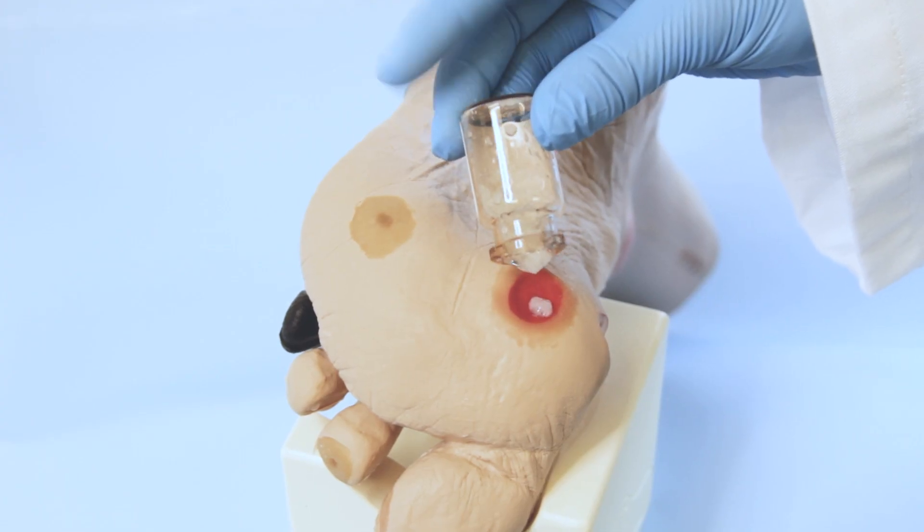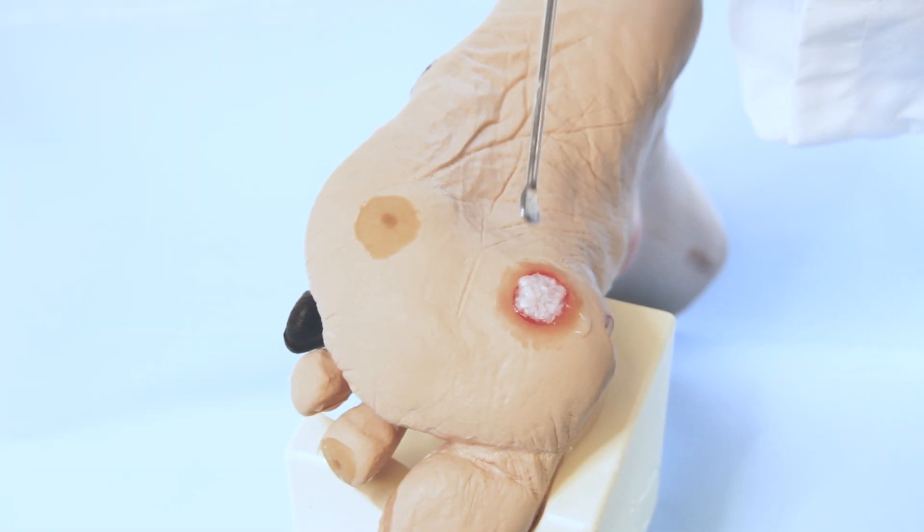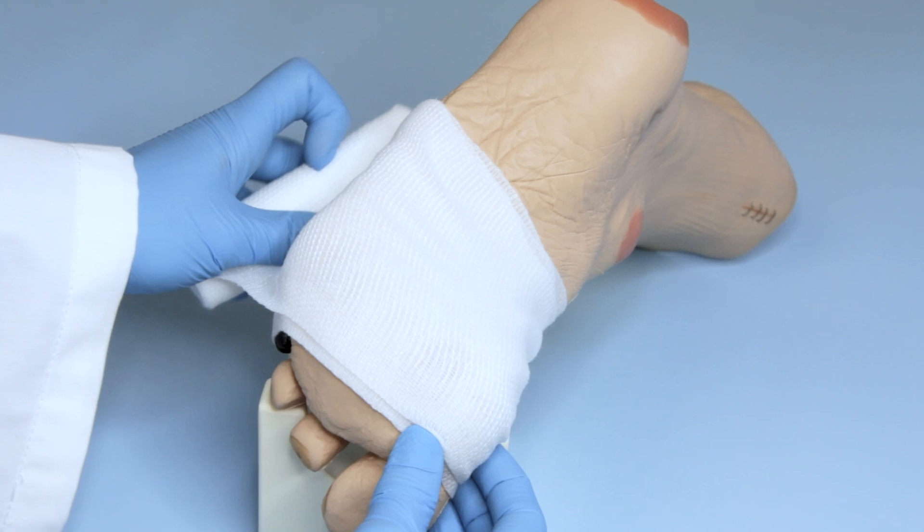CorPlex-P may be reapplied every seven days or as determined necessary by a healthcare provider. Change the secondary dressings according to standard of care, taking into account the level of exudate.